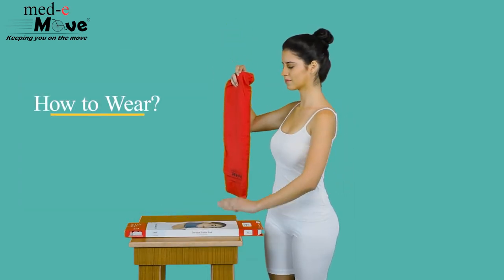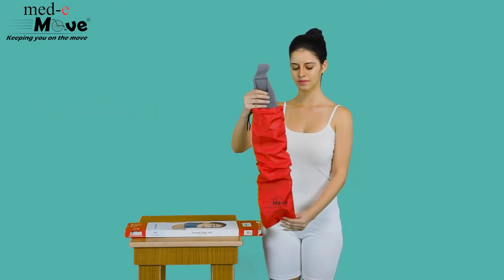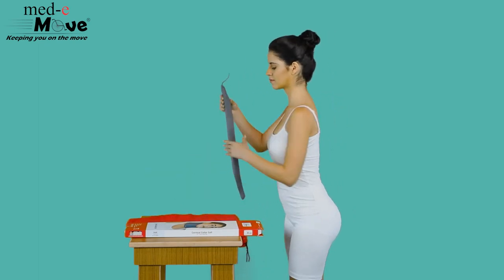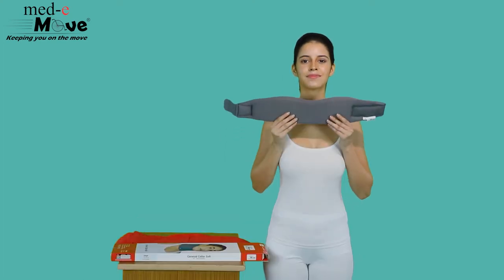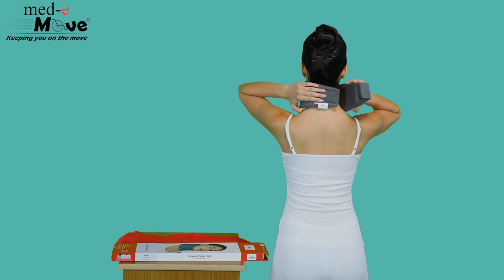Now let us see how to wear the Medimove Cervical Collar Soft. Ensure the collar is worn firmly and comfortably around the neck. Make sure the curve is placed under the chin and fasten the hook and loop closures at the back. The collar must be positioned in the center, supporting the chin and the cervical bone.